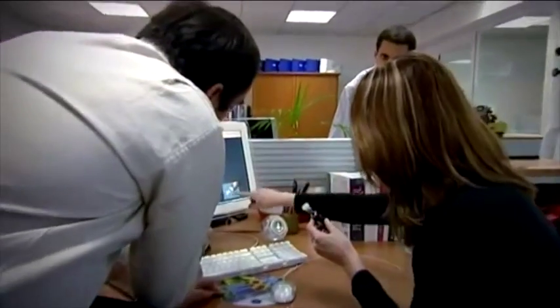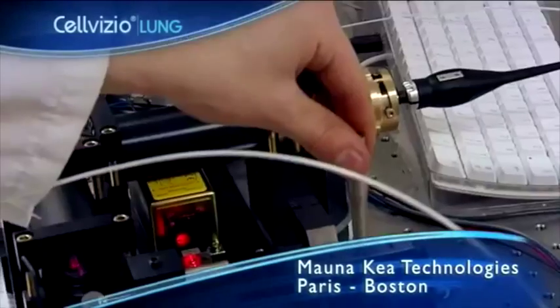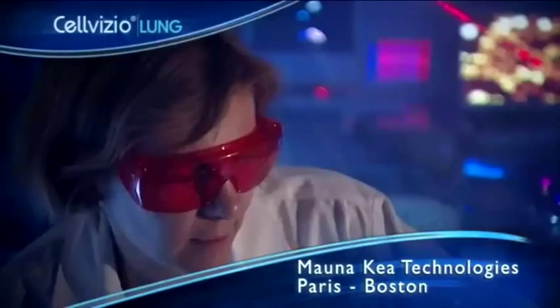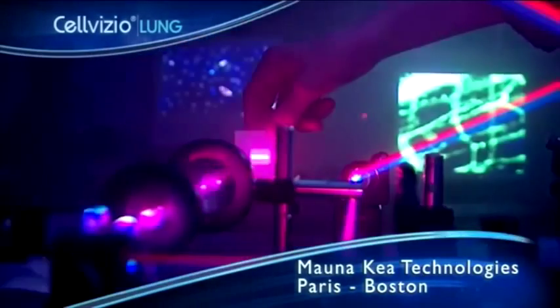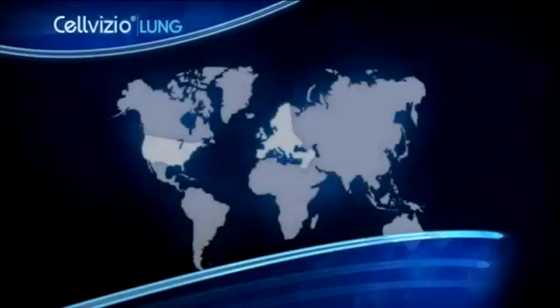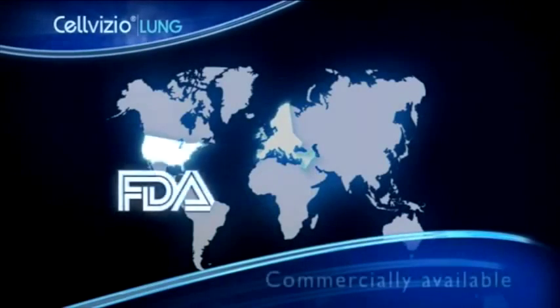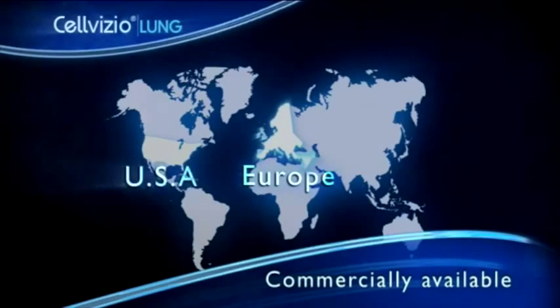Cellvizio Lung is the result of 6 years of research and development by Mauna Kea Technologies in France. A multidisciplinary team of professionals from the fields of biology, medical optics, astrophysics, imaging processing, and computer engineering work together with a singular objective: to provide clinicians with innovative, minimally invasive imaging devices that improve pulmonary patients' lives in routine procedures. Cellvizio Lung has the CE mark in Europe and is FDA cleared in the United States. It is commercially available both in Europe and the US.